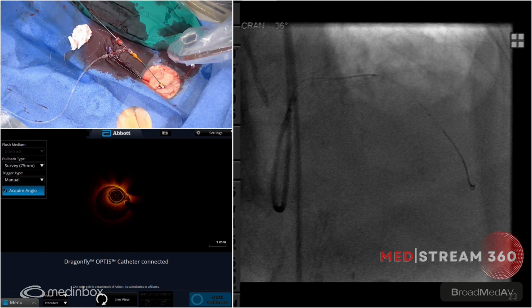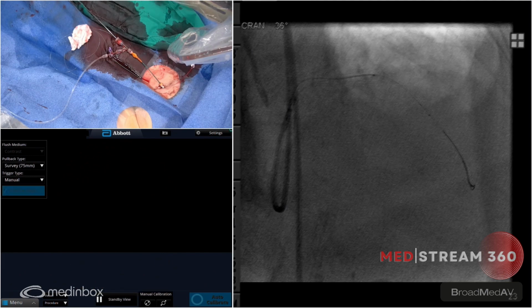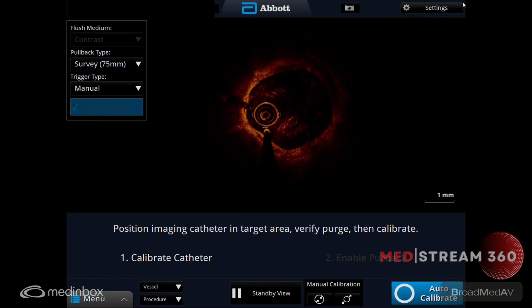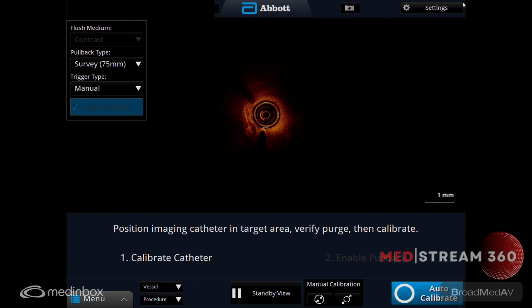Not sure if you'd see through the guide liner if you image that. Let's do live view. Yeah, let's have a look here, see if I have enough contrast to fill you in. Let me get the guide in. Love it. Perfect. Yeah, that should do it.